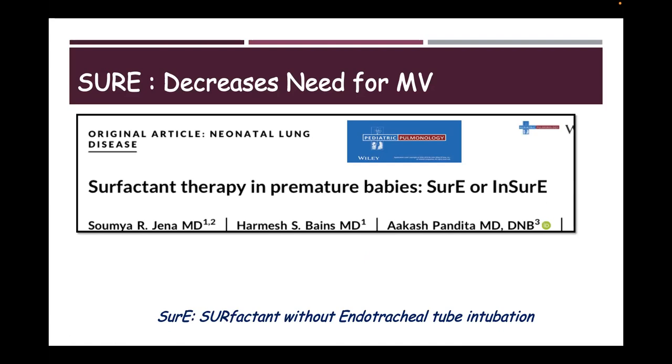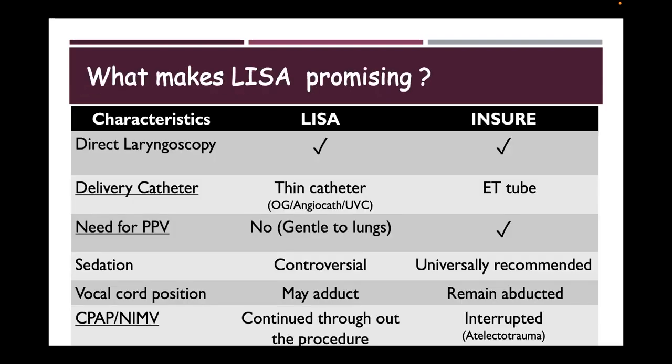We have published various publications. This is the largest RCT which we published, and we showed that with this technique, we can decrease the incidence of mechanical ventilation as well as BPD. Now in LISA, why is it important, why is LISA more promising?